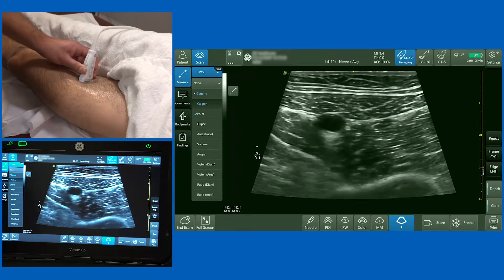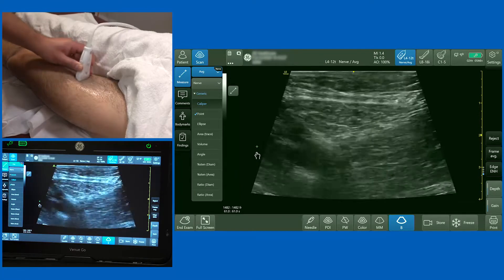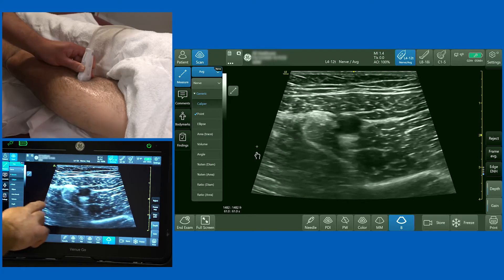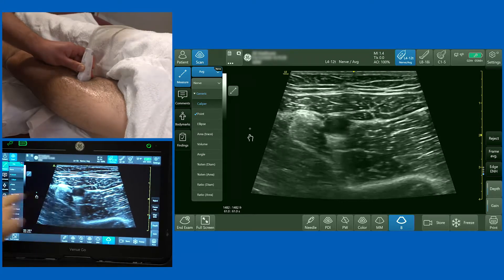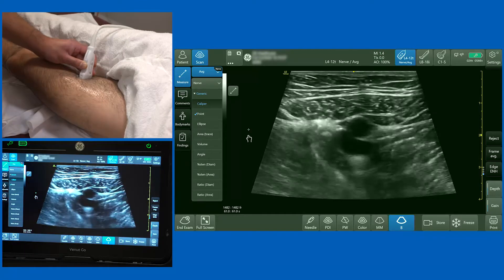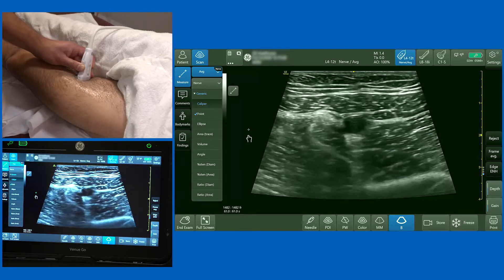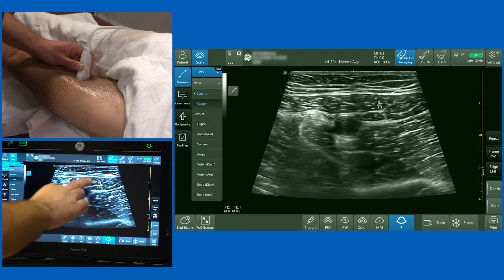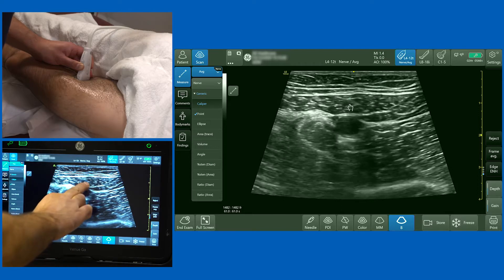I'm going to place the probe in the middle aspect of the thigh and the first thing I want to orientate myself to is the superficial femoral artery. Right in the centre of the screen here you can see a nice pulsatile superficial femoral artery. If I release my pressure you'll see the vein below it, and above the femoral artery you've got something that forms the roof of the adductor canal — this is the sartorius muscle.